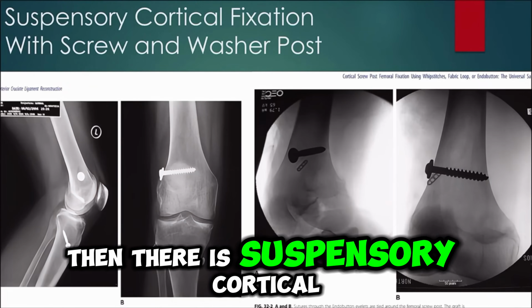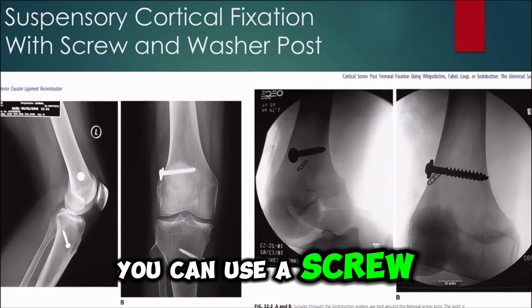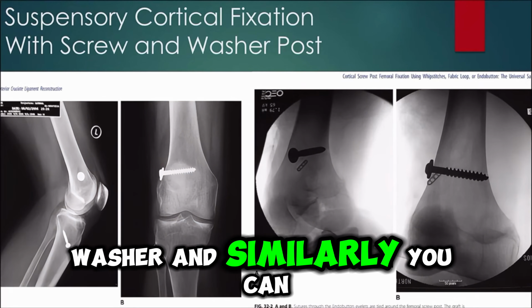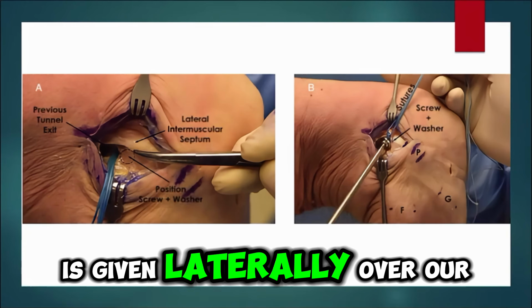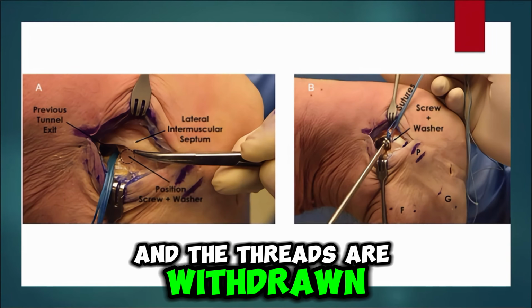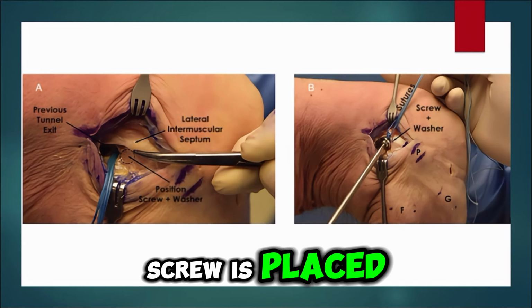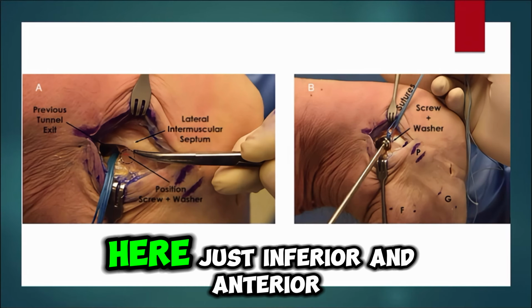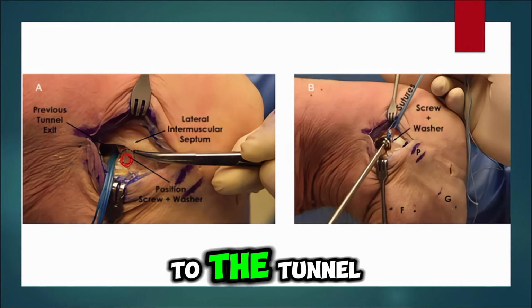Then there is suspensory cortical fixation. For suspensory cortical fixation, you can use a screw and washer. A small incision is given laterally over our exit site, the threads are withdrawn, the graft is pulled, and the screw is placed just inferior and anterior to our tunnel.